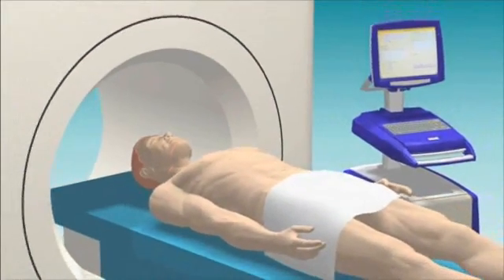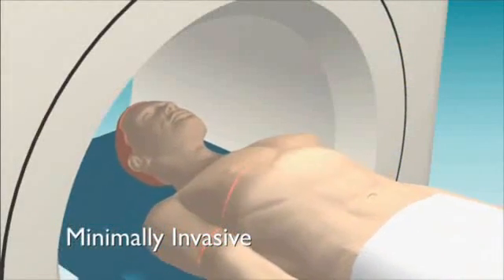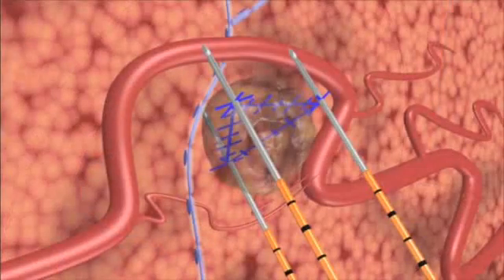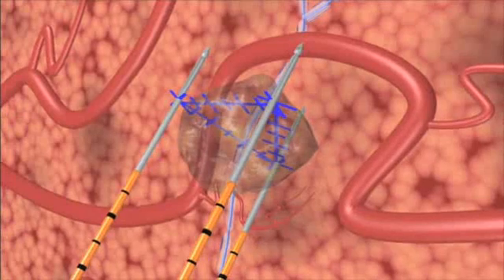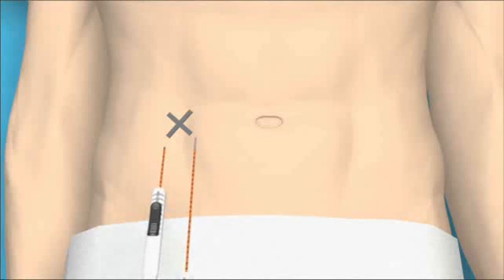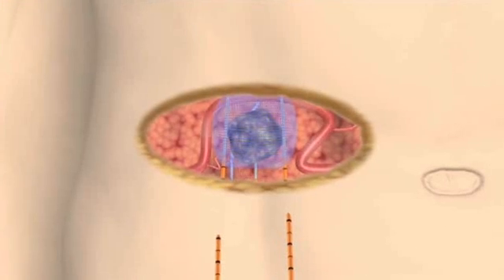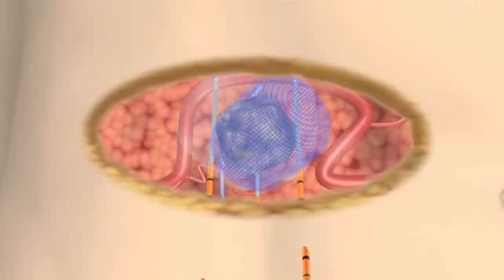NanoKnife IRE treatment is minimally invasive and is performed under general anesthesia with ultrasound or CT guidance. Preoperative imaging allows precise calculation of the tissue volume and shape to be treated, and aids the planning of appropriate positioning for the NanoKnife IRE electrodes. A NanoKnife IRE treatment consists of a series of 90 extremely short electrical pulses, each less than 100 millionths of a second. Cell death is induced within seconds and the patient can often be released from the hospital the same day.